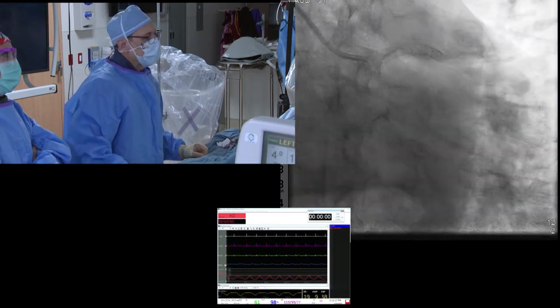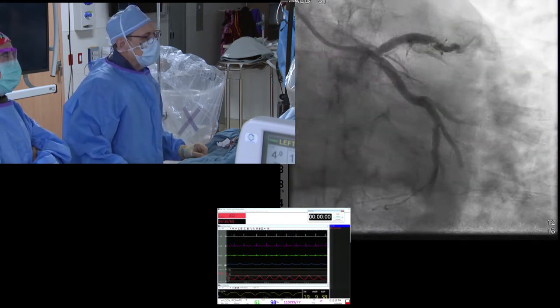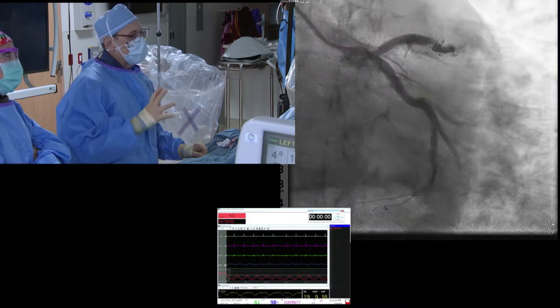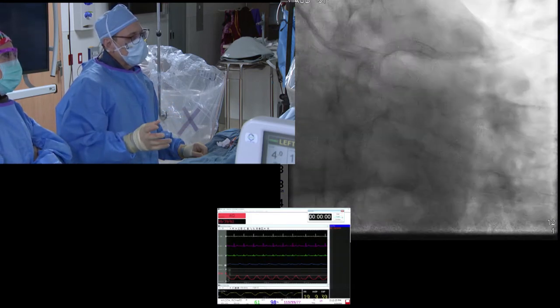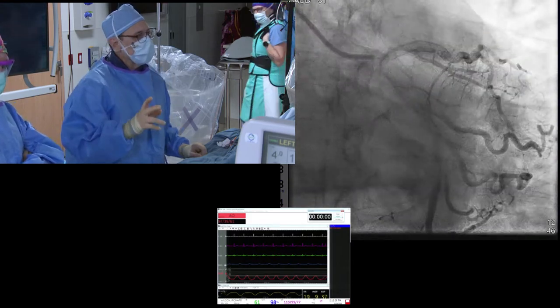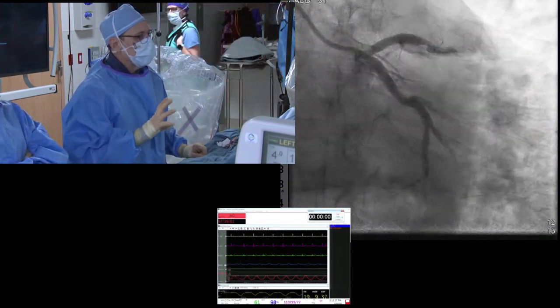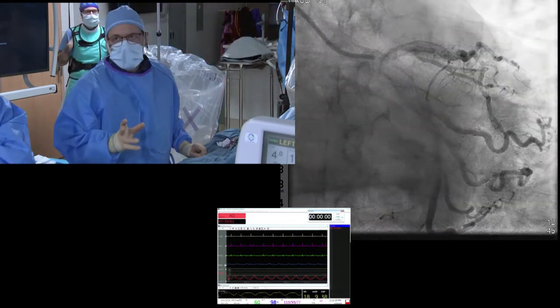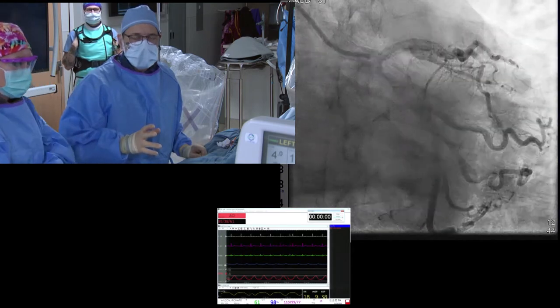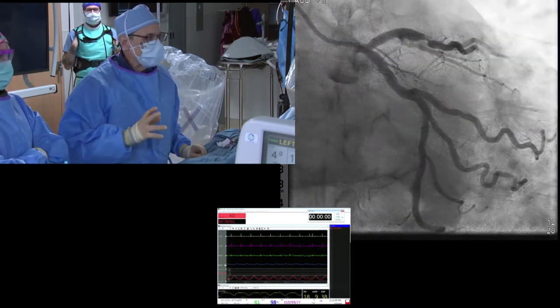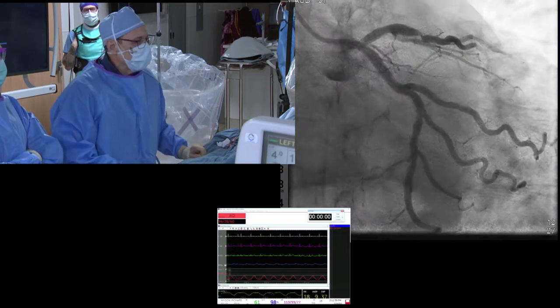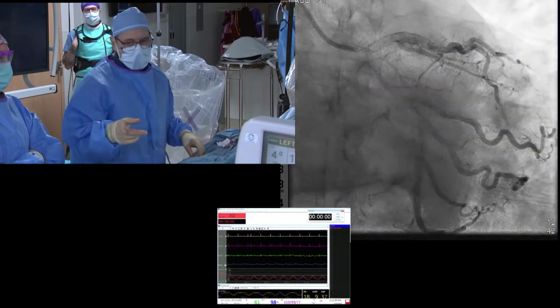This is an AP caudal view. The smart money right now is to wire the vessel and probably give a little touch-up, maybe with a 2.0 non-compliant balloon, just so that we can get our OCT device down the LAD.